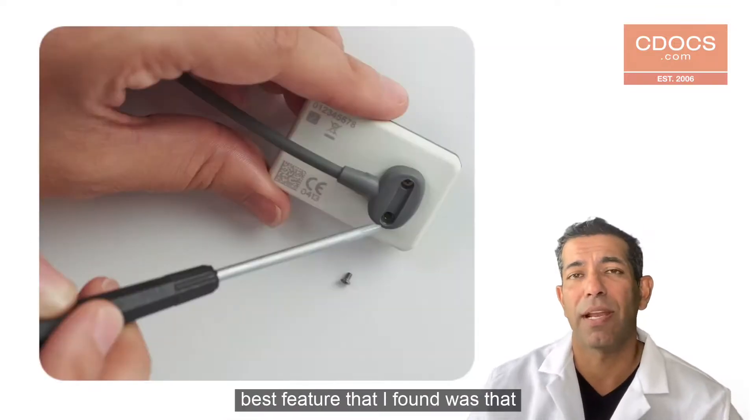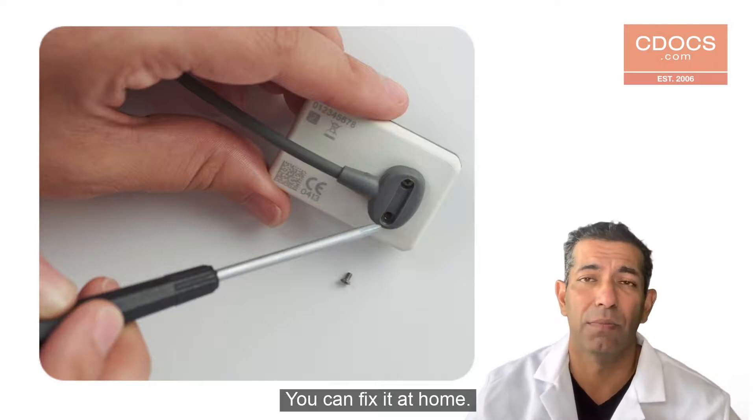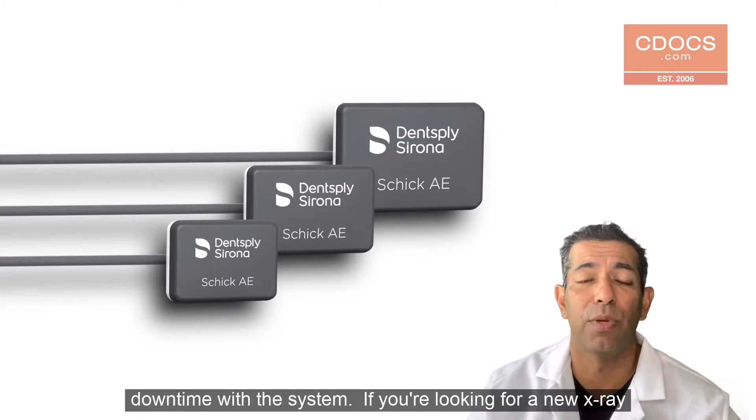I think the best feature that I found was that if there's an issue with the cable, you can fix it at home. You don't need to send it out. You don't need to send it to a technician. You have the ability to repair it. So it's virtually zero downtime with the system.